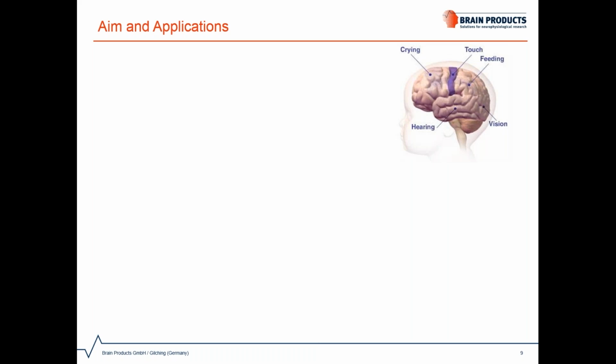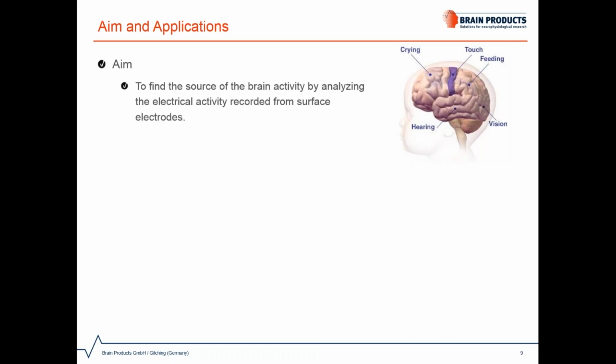using EEG, you have been using several signal processing techniques at the scalp level. Unfortunately, the scalp level analysis faces a problem in that the signals measured on the scalp don't necessarily indicate the active neurons in the brain. So you might be interested in applying source analysis, which enables you to trace brain circuits and unlock the secrets of the brain. So the aim is to find the underlying sources of the scalp recordings by analyzing the brain activity using the technique called source analysis.